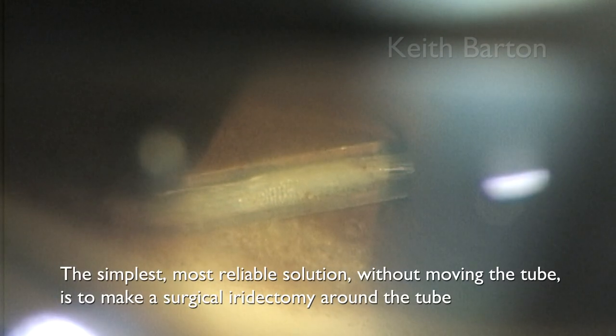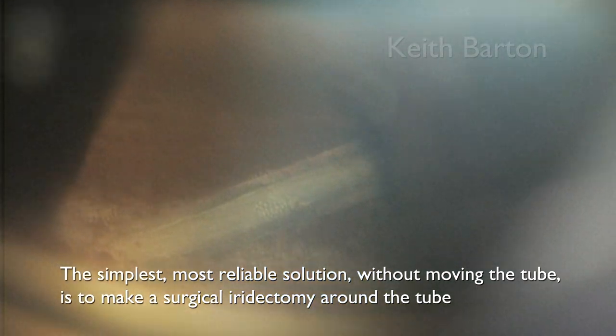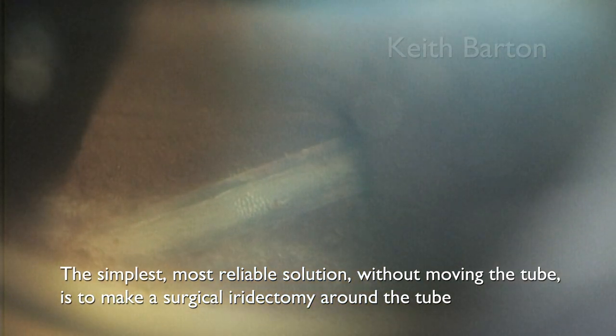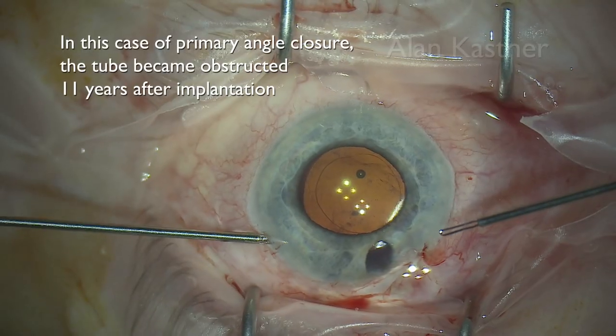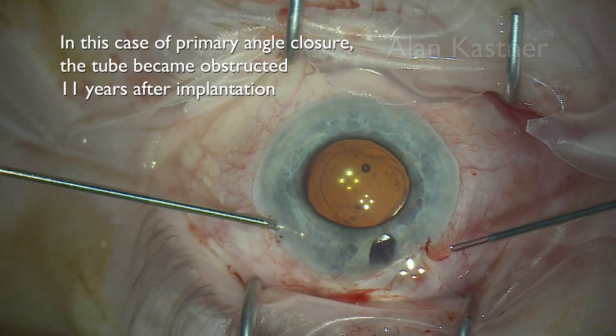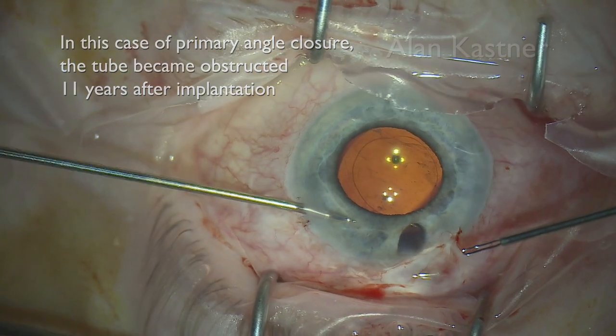The simplest, most reliable solution without moving the tube is to make a surgical iridectomy around the end of the tube. In this case of primary angle closure, the tube became obstructed 11 years after implantation.